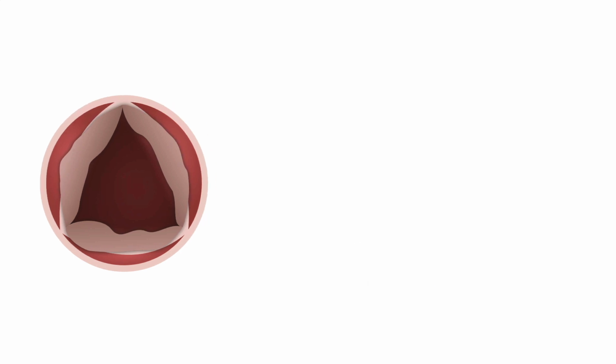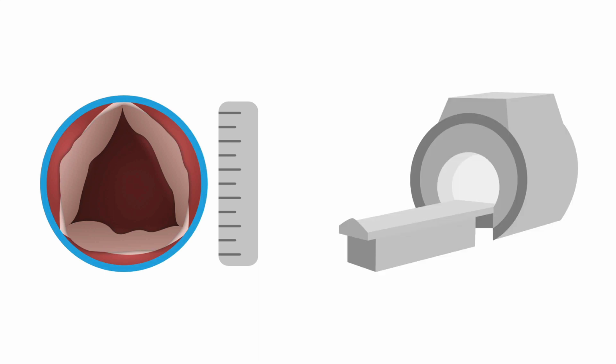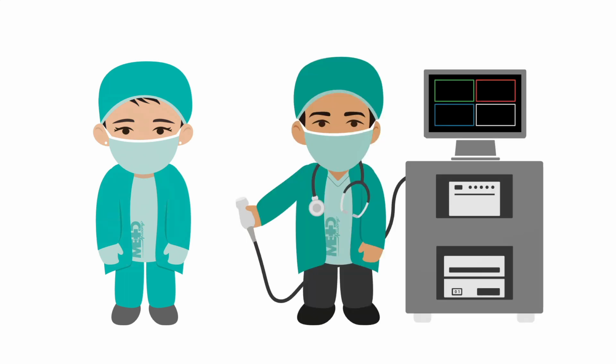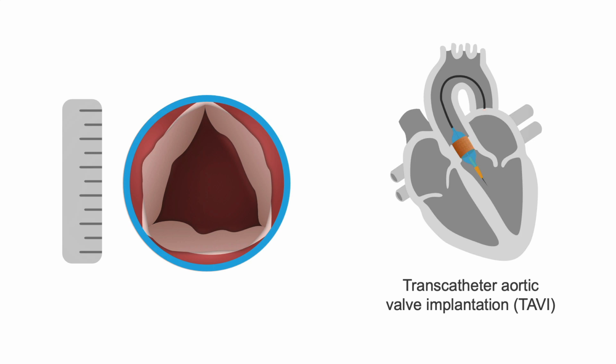Most patients will have their aortic annulus measured on CT before they undergo a procedure on the aortic valve. Multiplanar reconstruction mode can be used live during a procedure to measure the aortic annulus dimensions for transcatheter aortic valve implantation, also known as TAVI.